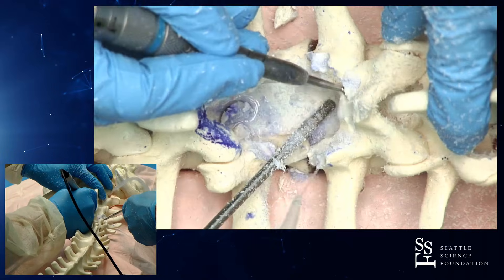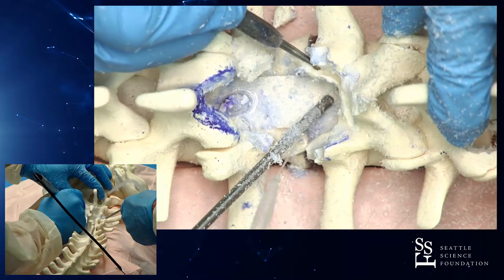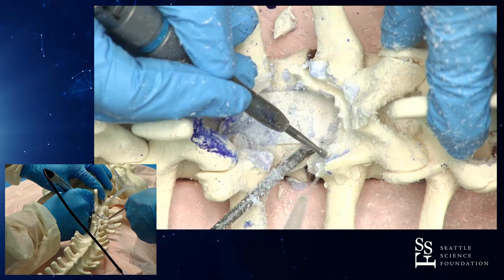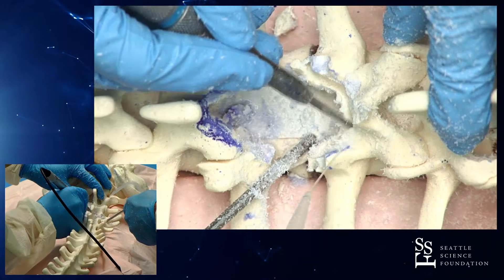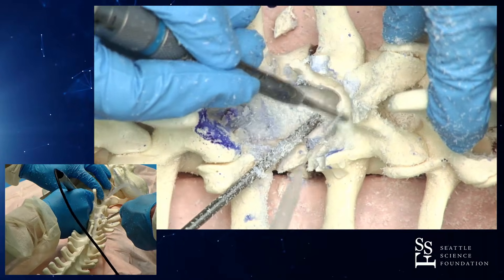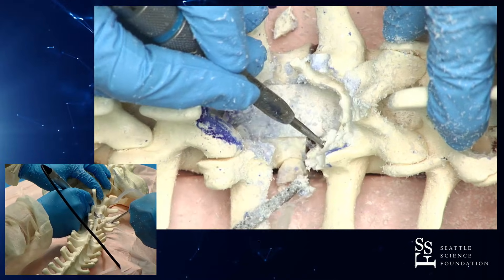Tell us about your breathing — nice and controlled. Nice diaphragm breathing. No pressing. And just like you're never pressing on your Midas or your high-speed burr. Smooth, slow strokes. And steady irrigation prevents the burr from getting gummed up. And hopefully, if you get close to dura, it prevents any thermal damage to your neural elements.